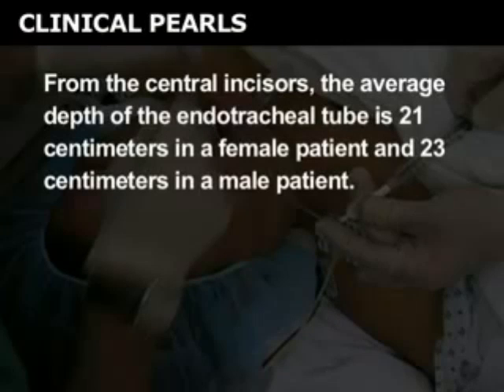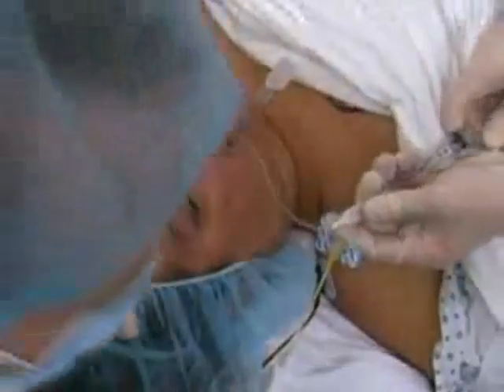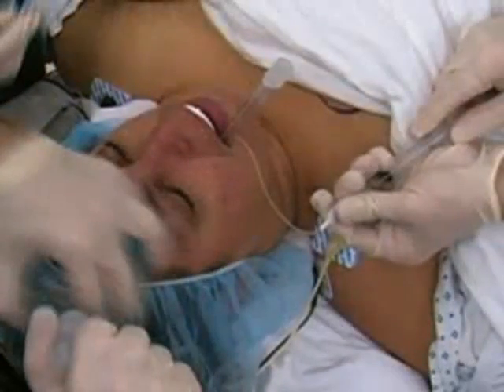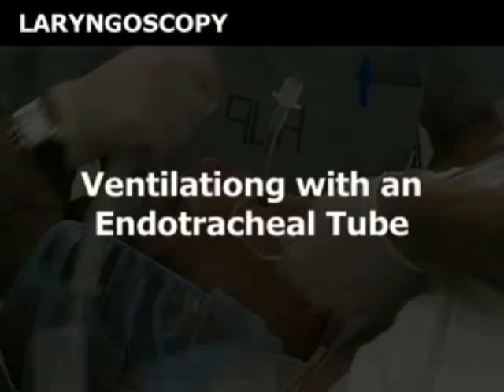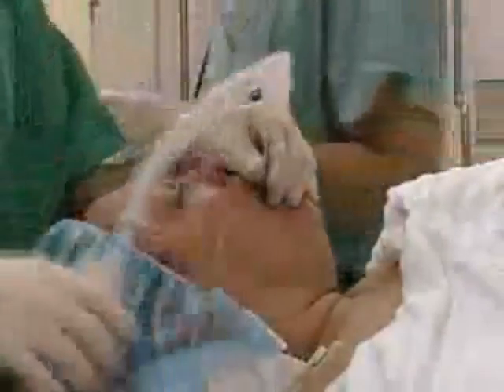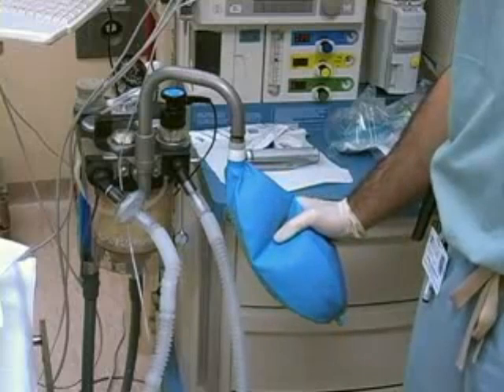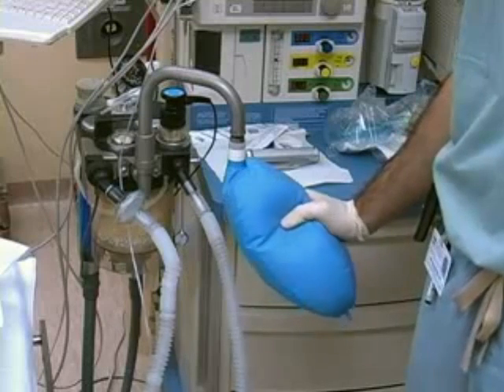From the central incisors, the average depth of the endotracheal tube is 21 centimeters in a female patient and 23 centimeters in a male patient. Carefully remove the blade. Inflate the cuff of the endotracheal tube with a clean syringe using the minimum volume of air needed to prevent a leak. Connect the endotracheal tube to the breathing circuit. Provide a gentle breath with the reservoir bag, not to exceed 25 centimeters of water pressure.